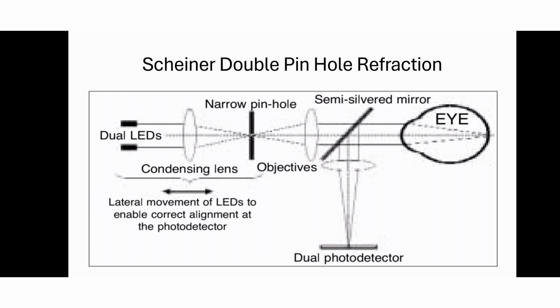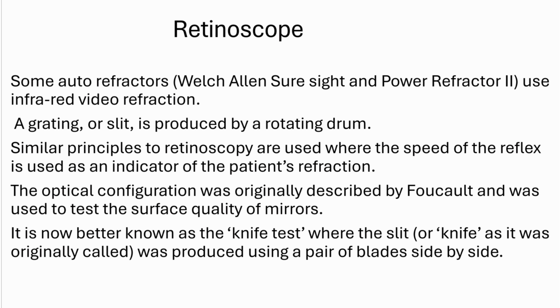It is apparent from that alignment of the photodetector is important. Basically, it is important that both the patient fixation and instrument axis are coaxial. If this condition is not met, effectively the objective refraction is conducted from an off-axis point and this leads to error.